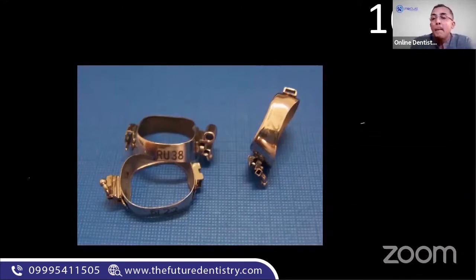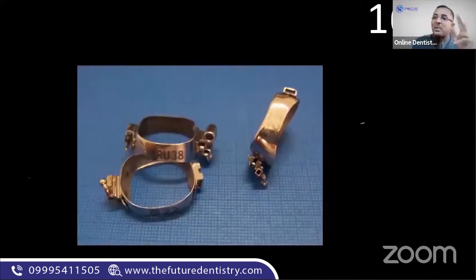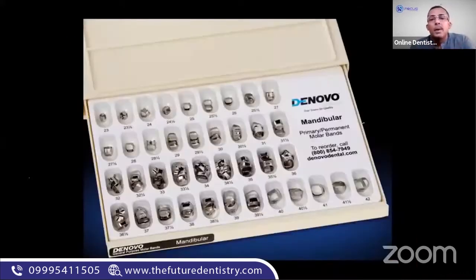These are called as preformed molar bands with molar tubes. So the molar tube, which can be bonded like that or banded like that, there are two types now. Please understand that. Yeah, weldable. Good. Dr. Akshada said that. Weldable to the band or bondable to the teeth. There are two types. Okay. Now, these are the preformed molar bands coming in the kit with multiple sizes, because once it's preformed, it won't fit everybody's teeth. So you'll have to have different sizes for different people.